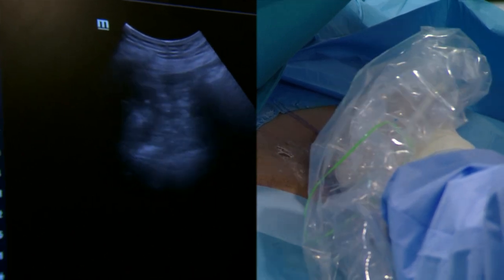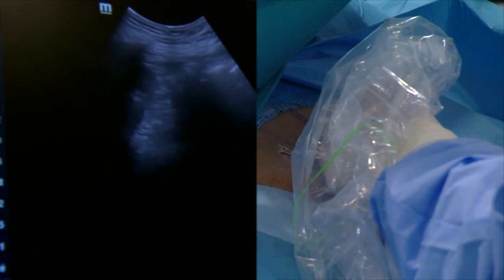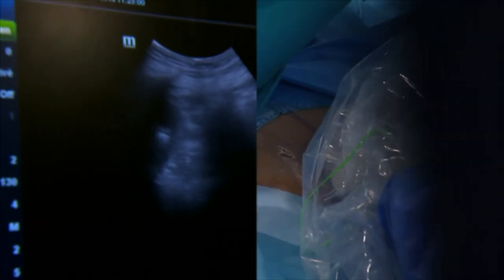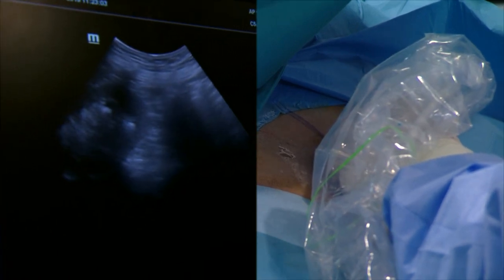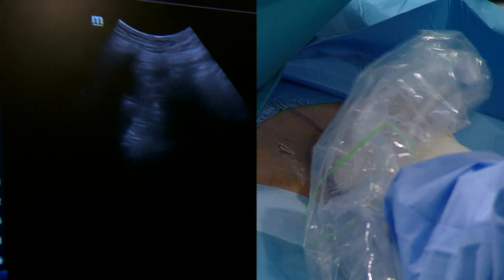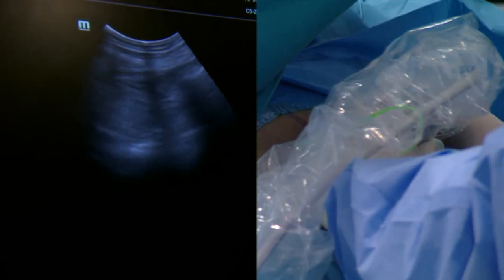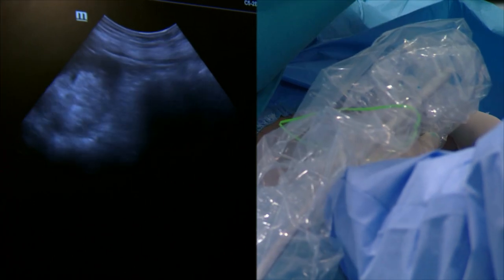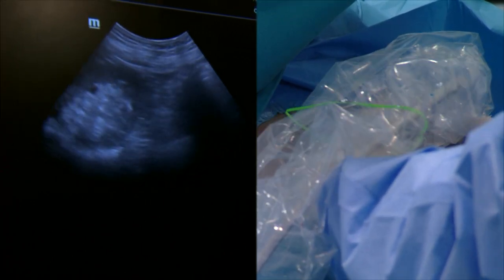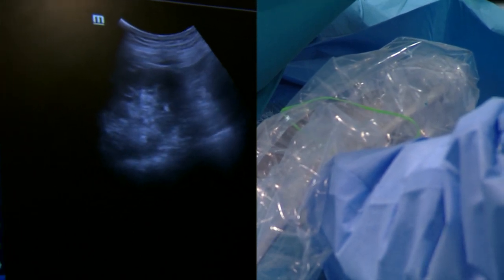The combination of needle and ultrasound is the key to success. When you try the guidance system, it will be helpful. It takes a little time. It is also a pre-operated kidney, which is not so easy. Not easy in puncture, not easy in dilatation. Now we are approaching the lower calyx.